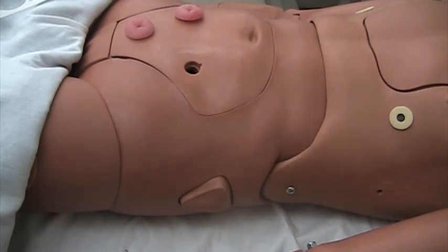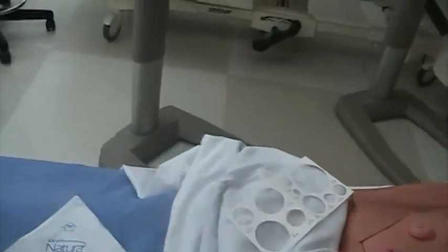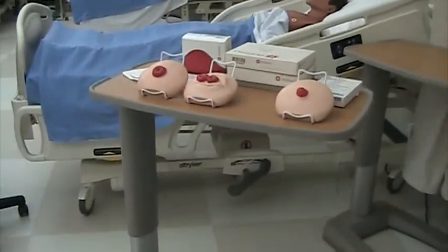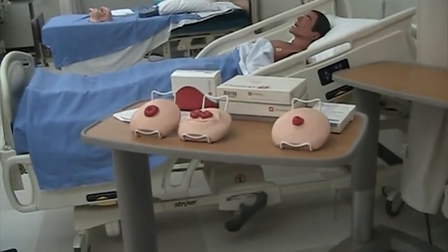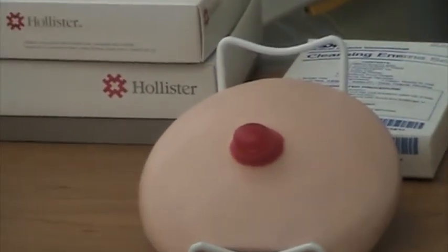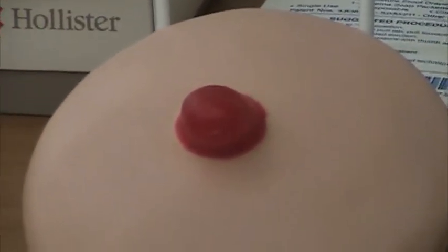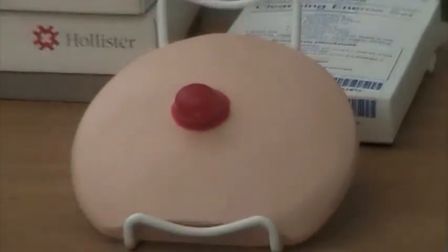So what you see over here are some models that represent ostomies. Okay, and these are just different types that you would see. Okay, so here you would see a little out pouch. You would still measure it the same way I told you, and when the patient had a bowel movement, it would just come right out of that.